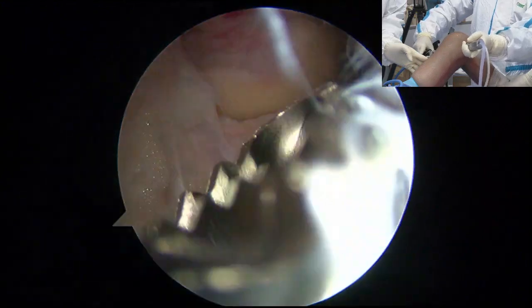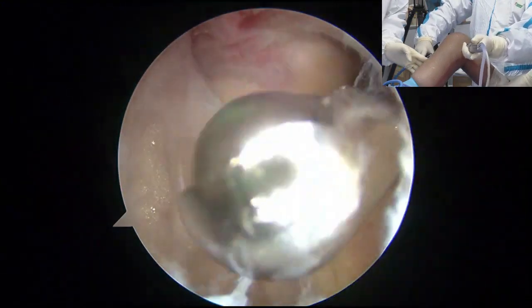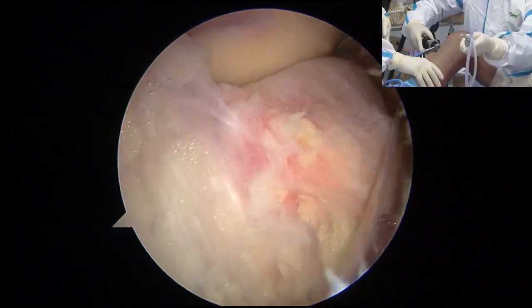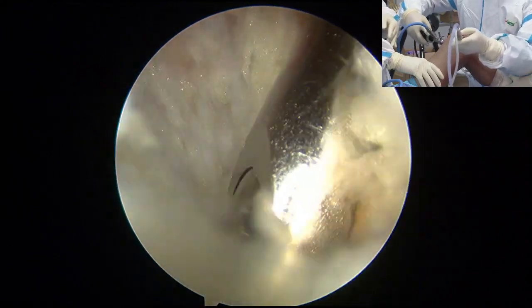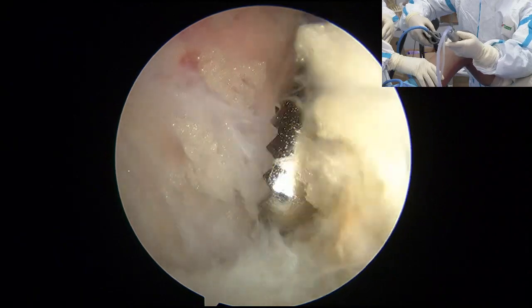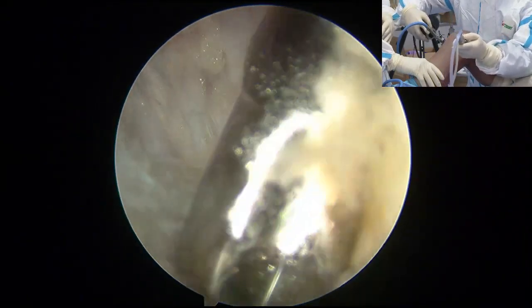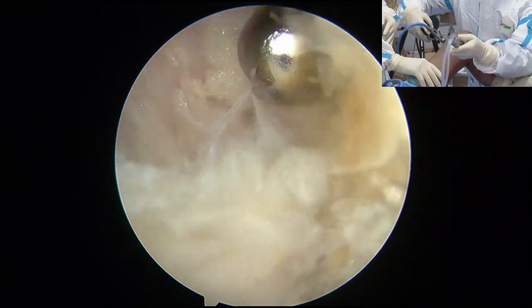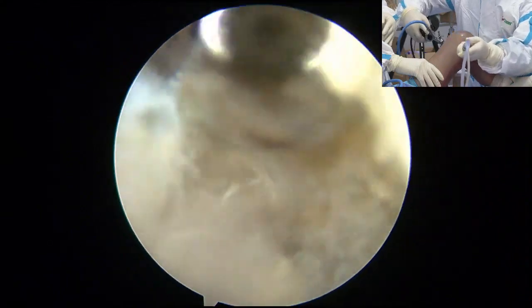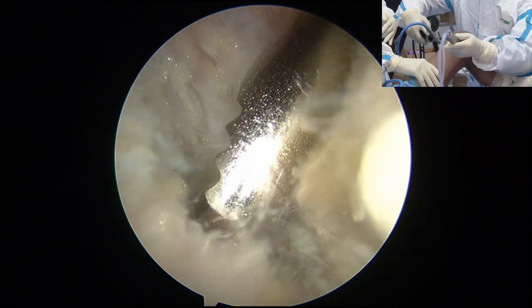Okay, now you're going to the lateral side. You can see the lateral meniscus and also the popliteus tendon. I show you. Okay, so you can see very well this is PCL, right? You turn your scope down like that. Now we enter the lateral compartment and see the meniscus and popliteus. Here, after you clean this, you can see some popliteus muscle. Clear the soft tissue here and we will shortly see the popliteus.